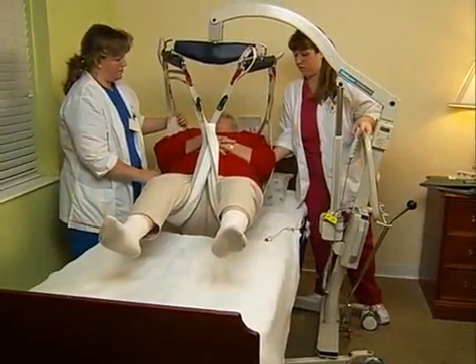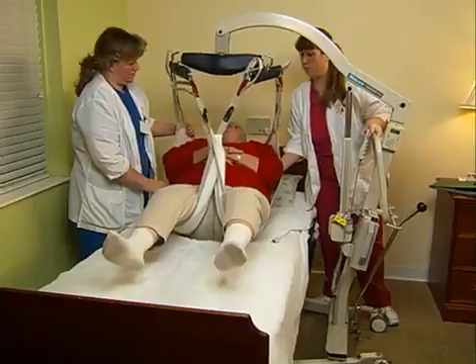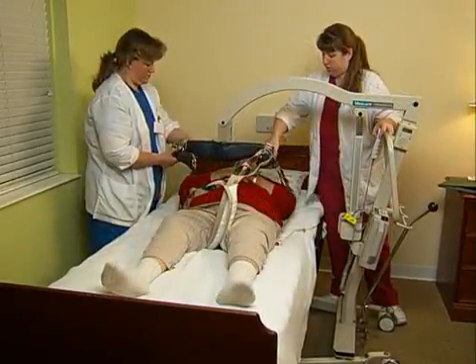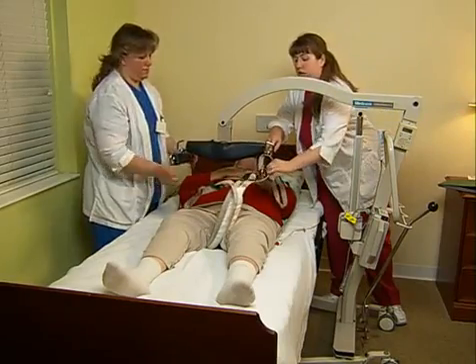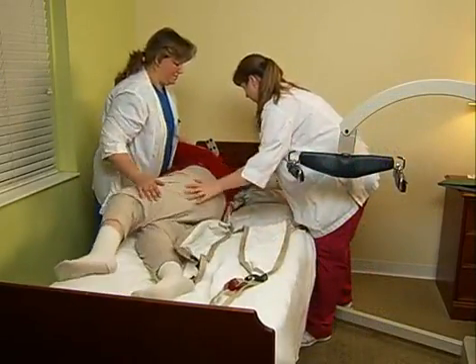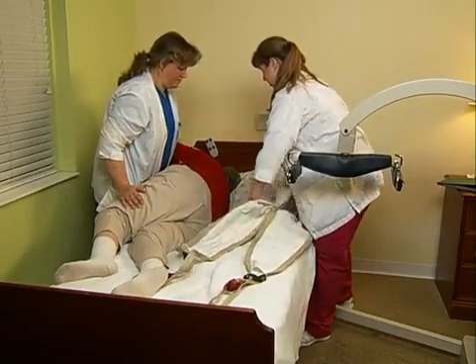Lower the patient gently onto the bed. Detach the sling from the scale. Roll her over the sling and remove it.